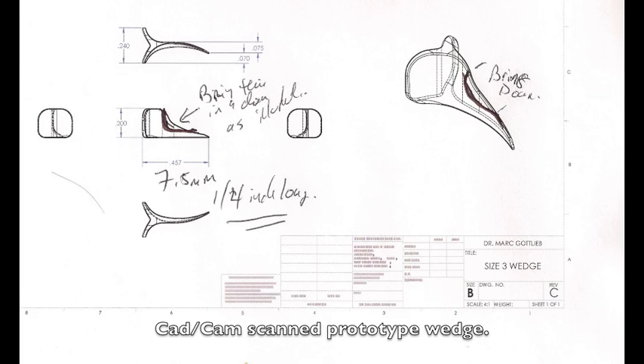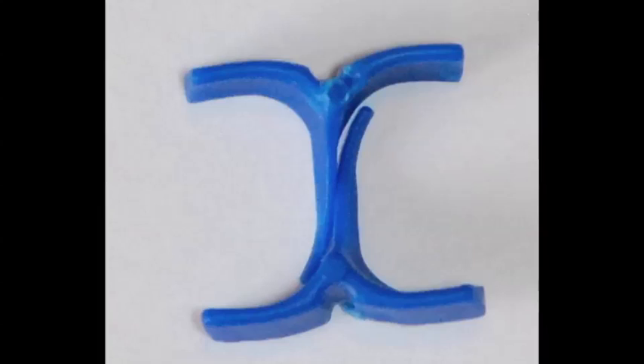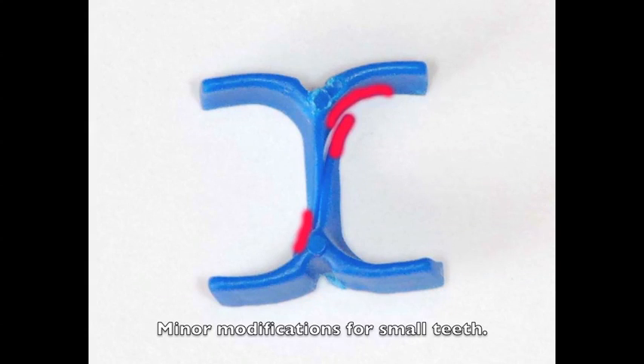Once I was satisfied with my prototype, I then scanned it in using CAD-CAM technology to develop a set of wedges that can be placed from the buccal and lingual. As you see, they now slide past each other, separating the teeth and swaging them together. For small, narrow teeth, you may need to modify the tips to fit into the embrasure space.